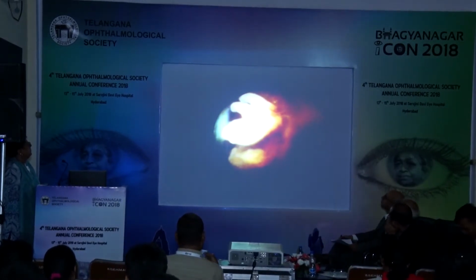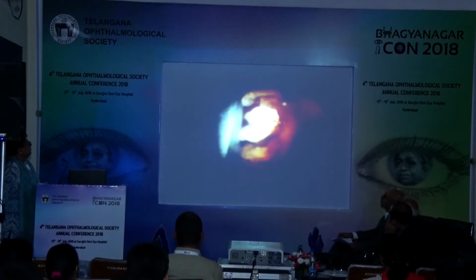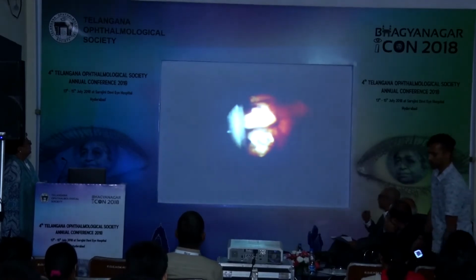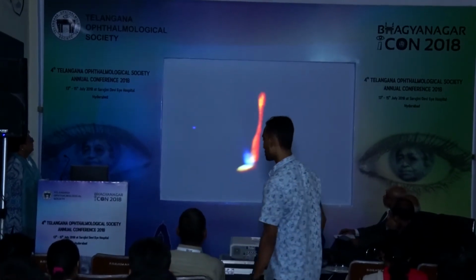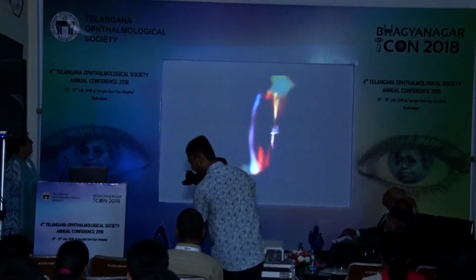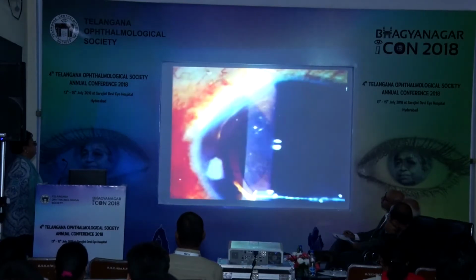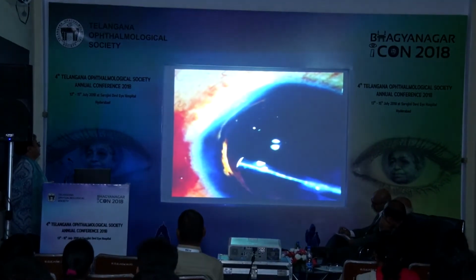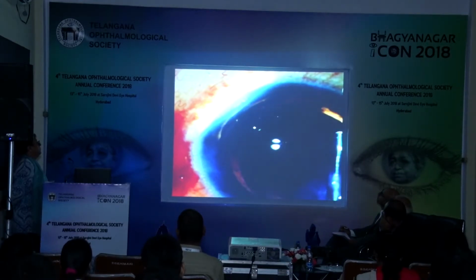Care must be taken to avoid the application of too much energy, causing the ciliary process to pop. Overtreatment may lead to excessive postoperative inflammation and a breakdown of the blood-aqueous barrier and its sequelae. It is possible to ablate approximately 30 to 40 processes through the phaco-incision.